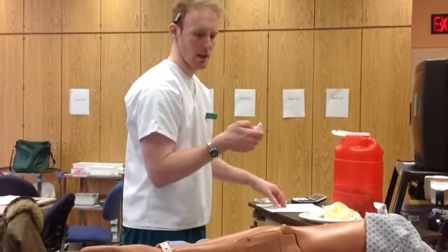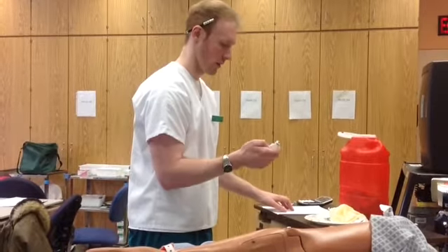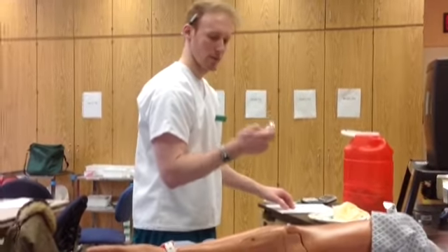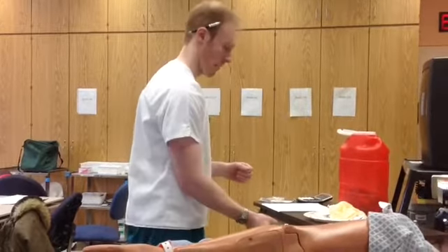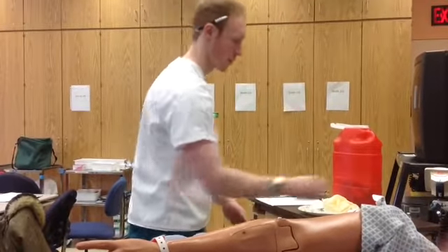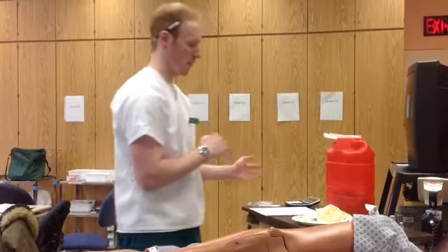He's going to be getting it intramuscularly, and he's getting it for infection. At that point, I can put my medication back into my drawer, lock my drawer, and then take my supplies to my patient.